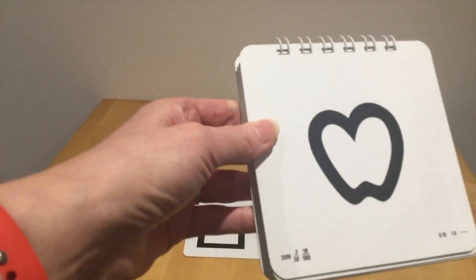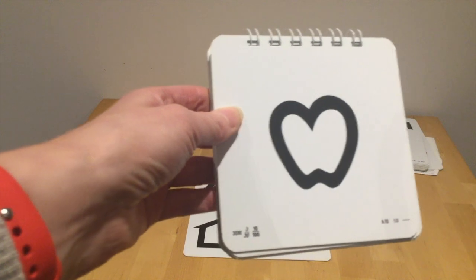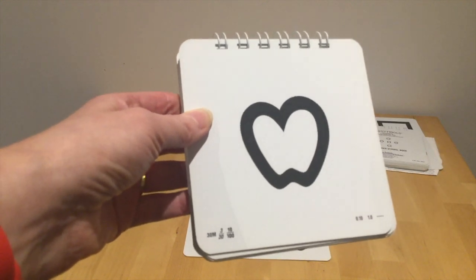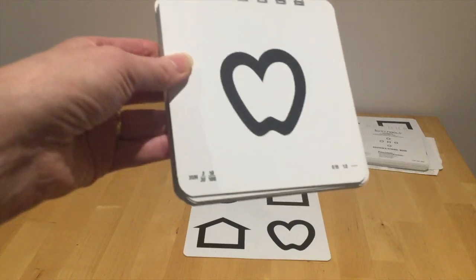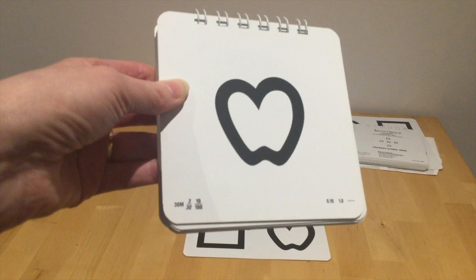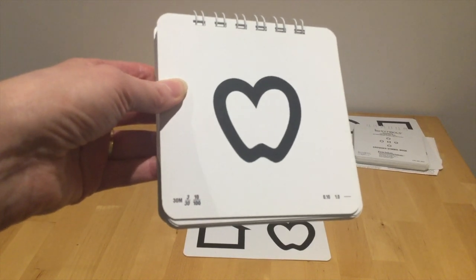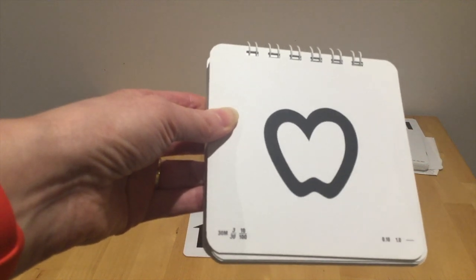And then flip that over. Here's our first picture of our apple or heart, whatever name it's given. At the bottom the acuity is 3/30. There's also logMAR on here as well, 1.0 in the corner.